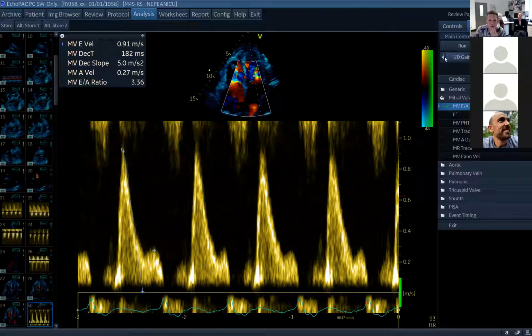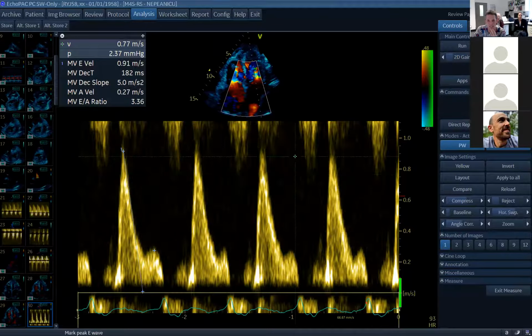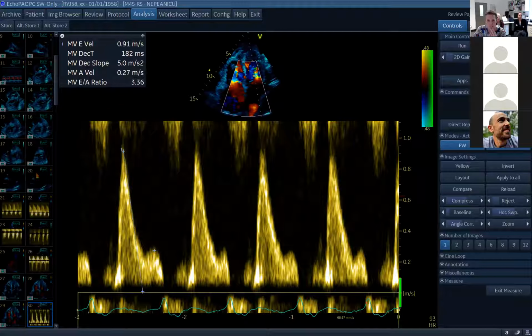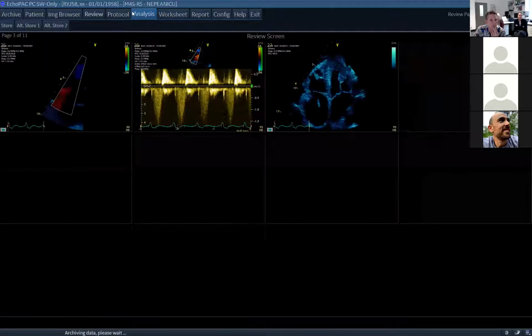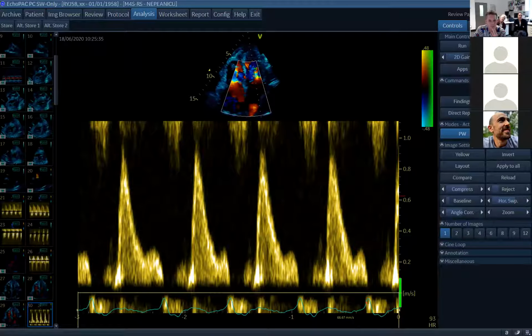Because also I've got my gain too high on this one, and I wonder if I can actually change it down. Yeah, nice. Yeah, that's how we change it. Because again, you see, it's quite overgained, isn't it? I just wonder if I can actually change it while I'm here. I don't think I can. Let me just go back to that. There we go. It doesn't really work very well, does it?